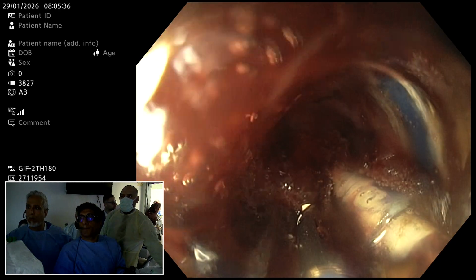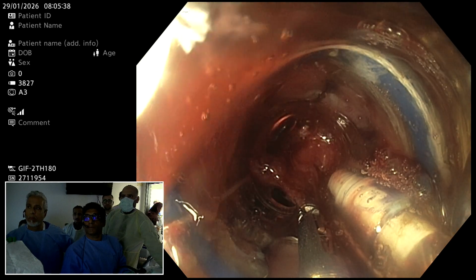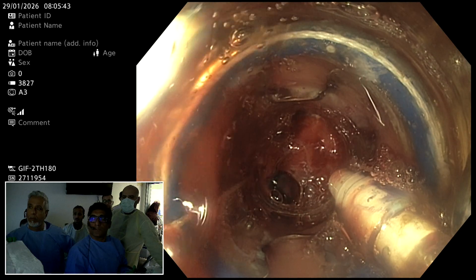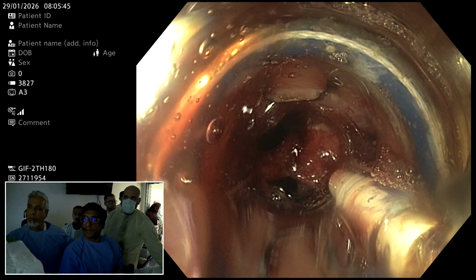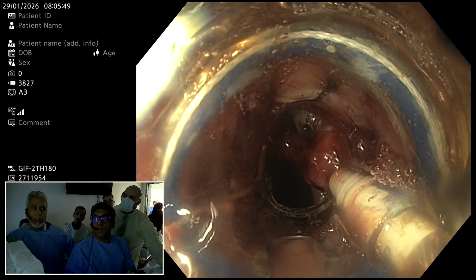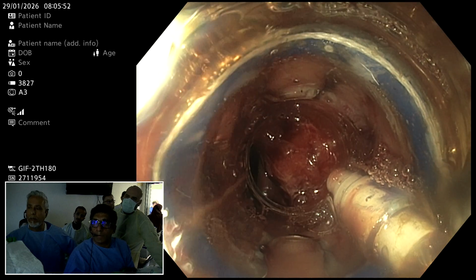No, no, not one. No, type 3 is in the stomach, in the stomach only. The classification does not apply to the duodenum, it applies to the stomach. It's quite hard.